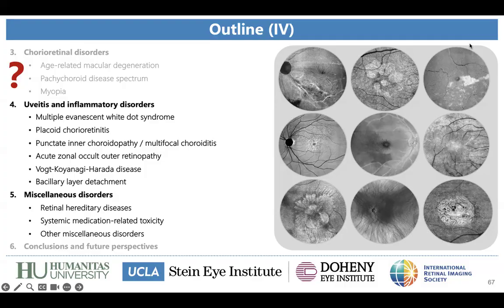And we followed these patients, and we noticed that these hypertransmission defects closed after the resolution. Can you add something on this point? I think that she is preparing this paper, and I don't know if you have any comments.